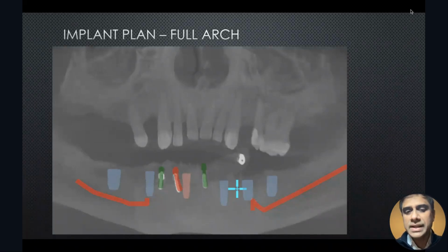If you have a spinner or something like that, yes, you have to do some modifications, but how often does that happen, right? If you use the right size of implant, right length and everything, you are going to be able to get some primary stability. That's why it's so different, and that really motivated me to go from just single placements to full arch cases. Next, please.